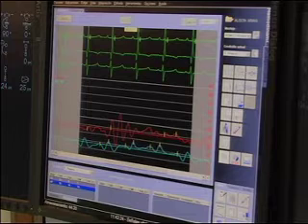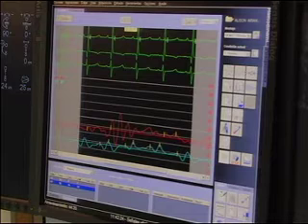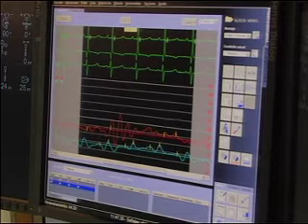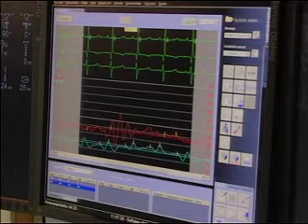The second plan is to redilate this ASD. And the third plan is to put a stent on the ASD. I want to know what the audience thinks. We could see if someone would come to the microphone and say what they would do.